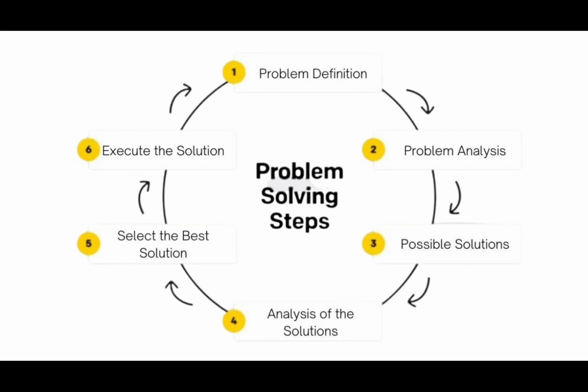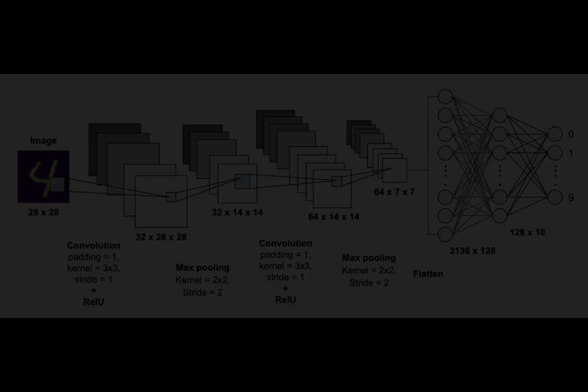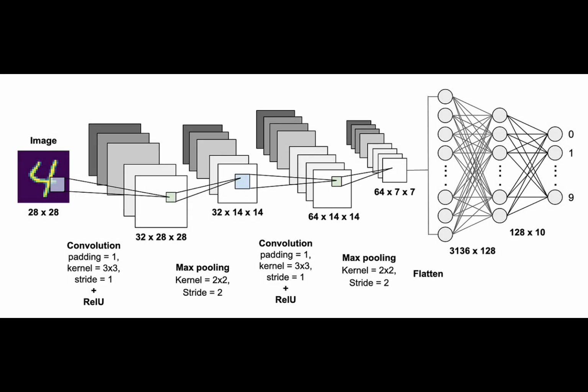details within an image. By analyzing it, we can identify significant patterns, features, and elements that can help conclude and make an accurate diagnosis. However, with image analysis, we need to use a certain type of model that will allow us to classify which disease that person may have and to accurately classify it. This model is known as a convolutional neural network, or a CNN.